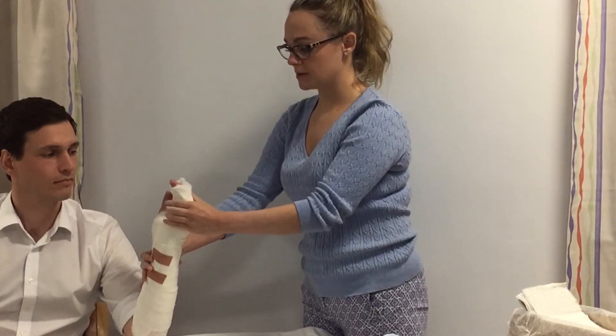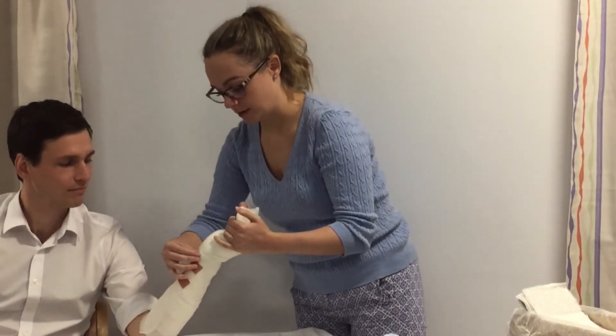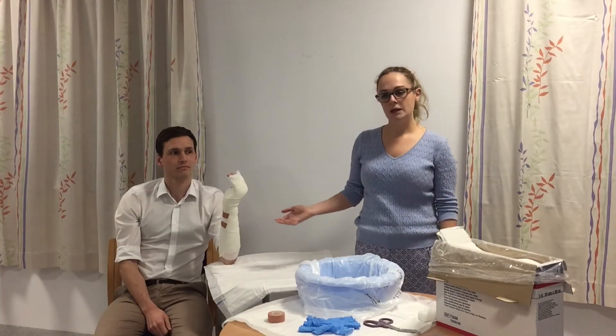It's now nice and hard — it will still feel warm. You can add a little bit more tape if you feel it isn't going to be very secure. Now we have a nice volar slab.